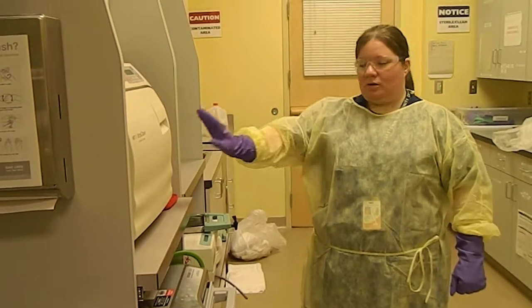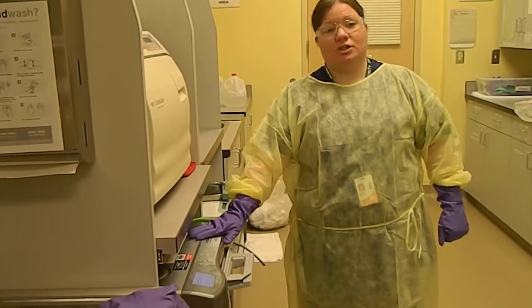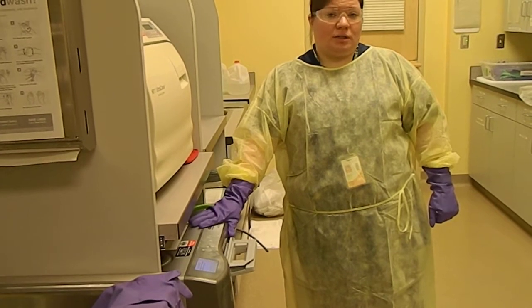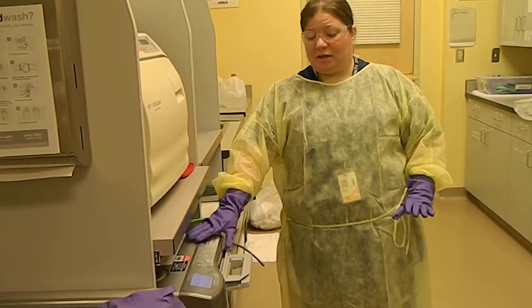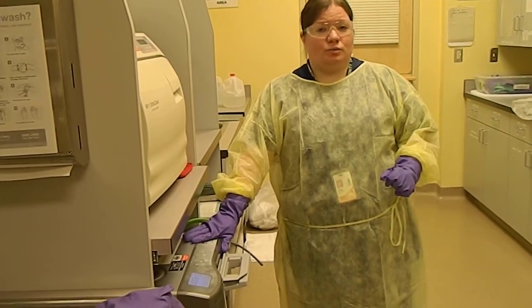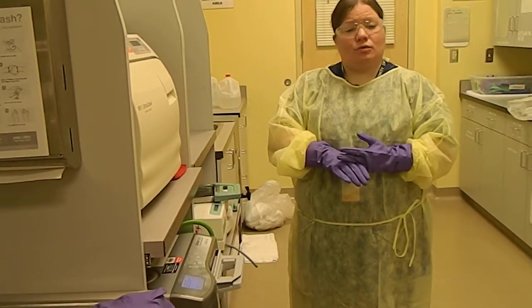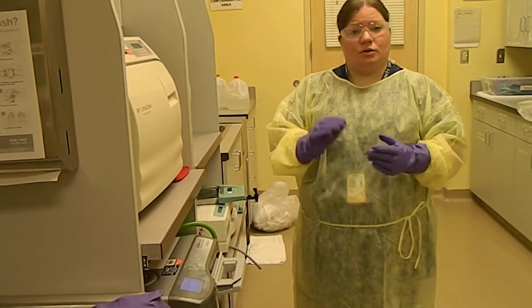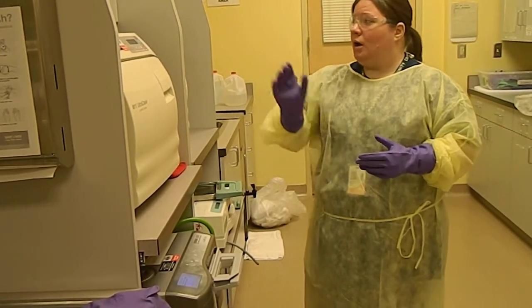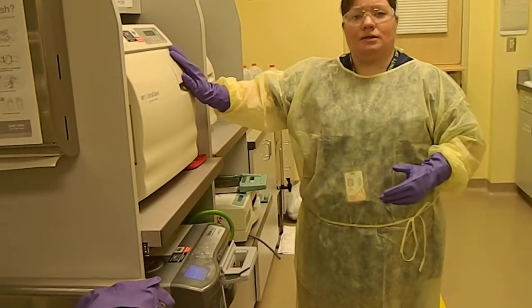Just like the autoclave I mentioned previously, we have another machine that we use to sterilize called the Statim. This is a fast sterilizing machine, and we typically reserve it for select things like your XCPs, anything plastic or rubber, like parts of your motor — the slow speed, polishing motor. We have a whole list up here of different things that should go into the Statim and not into autoclaves.